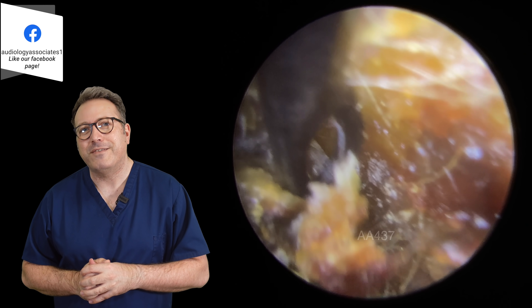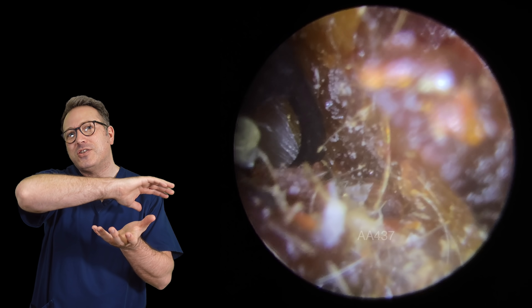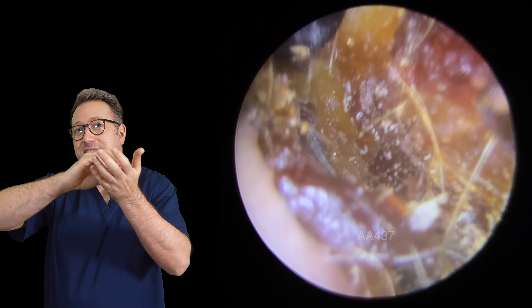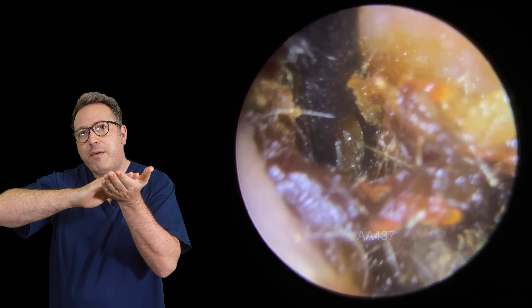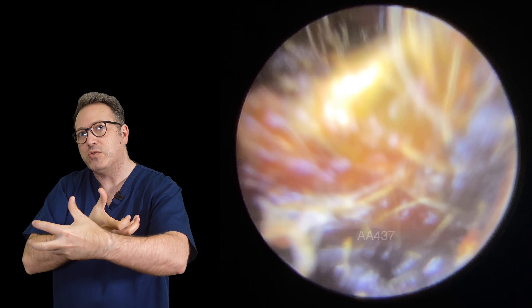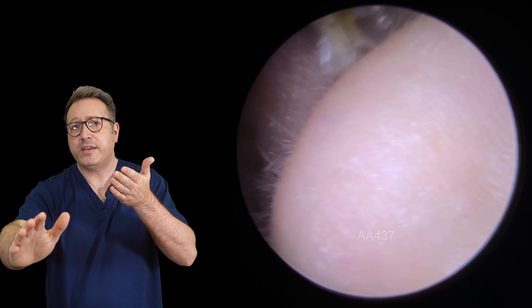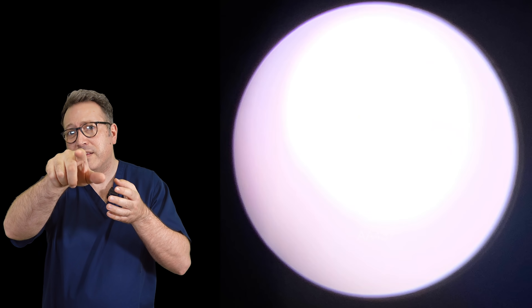Jobs and horn comes in to save the day — it just goes in there and starts to draw this down the canal. What I'm using here is the structure of the wax at the base of the canal against itself. It's quite hardened up; the jobson horne was actually flicking off the top. If we can just get through that hole, separate some of this off the right side and use the structure to draw this around the corner — there we go. We got behind that and drew the whole plug out in one go. The lighter material underneath is the dry skin, and you can see there was a little tail of dry skin further on, separated from the side of the canal wall.